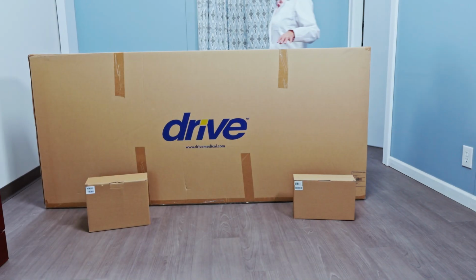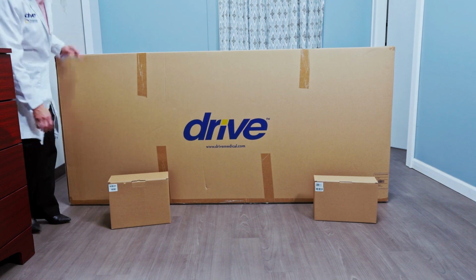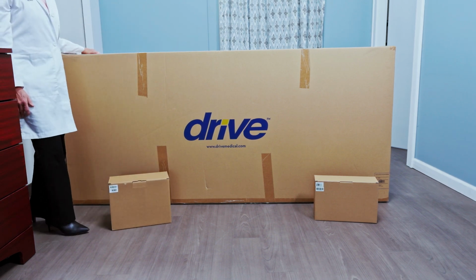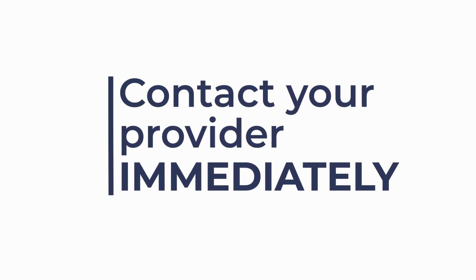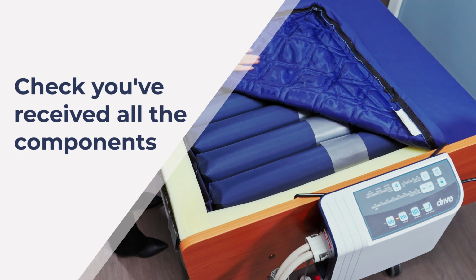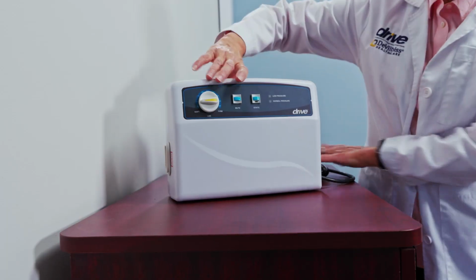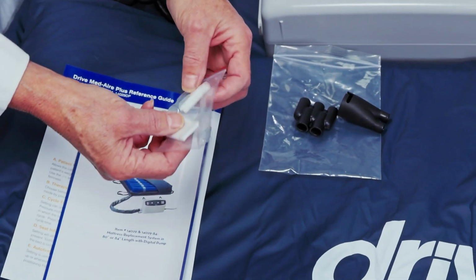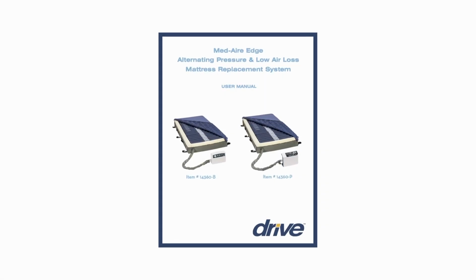Begin with the box on the floor or another suitable stable surface. Unpack the box and inspect for any damage which may have occurred during shipment. If there is any damage, please contact your provider immediately. Next, check you received all the components: one mattress, one control unit and cord, a small plastic bag of extra air filters, a quick fill pump adapter, and an owner's manual.